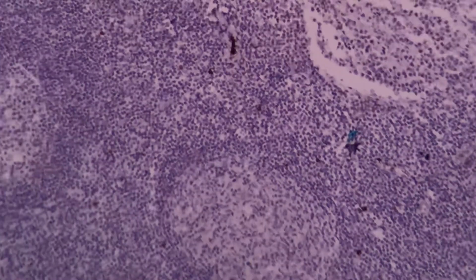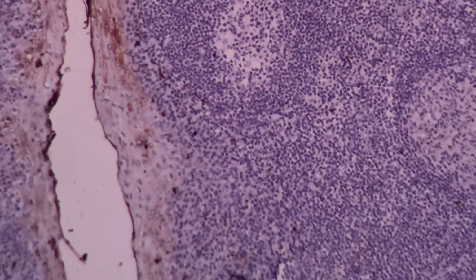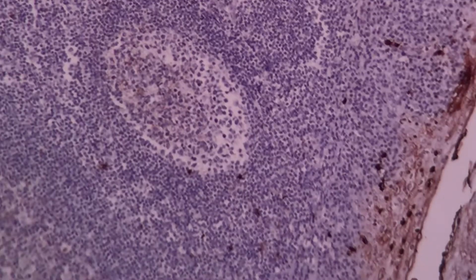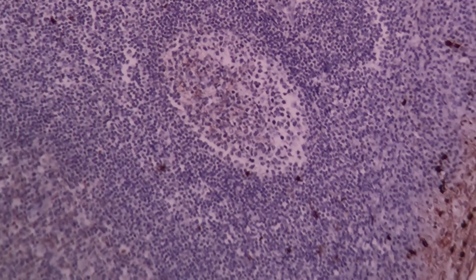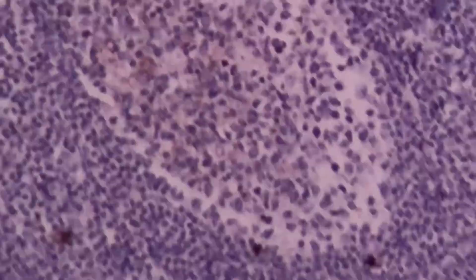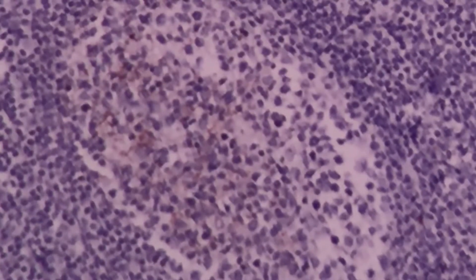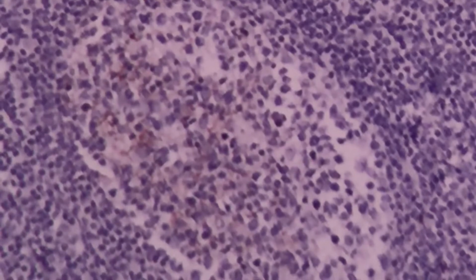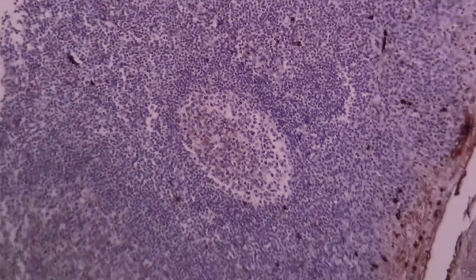You may appreciate some degree of faint staining towards the periphery, like here in this case. You could appreciate that occasional dendritic cells are getting stained with CD15. So that is normal.